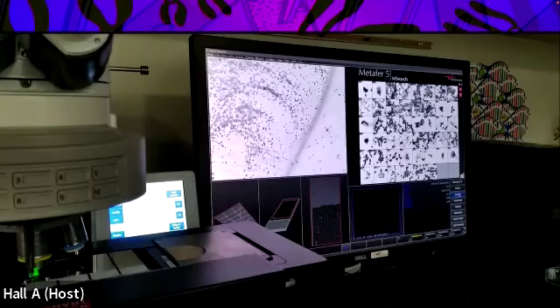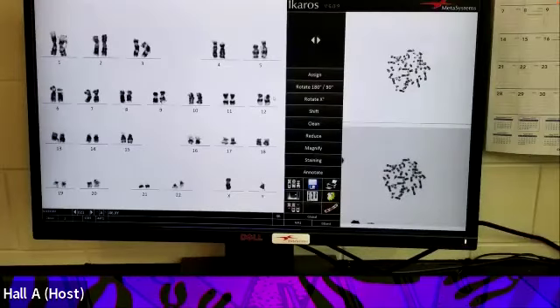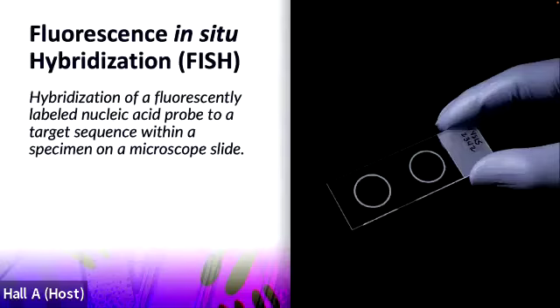This is just a little close up of the actual system that we're using, and analysis can be completed very quickly using the software that we have. We can use the archive, and it can be stored in the cloud, as opposed to a program that we used 4 years ago. We have had great success with conventional cytogenetic analysis, but it can be limited.